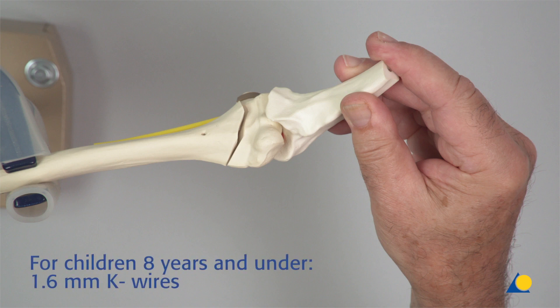For children 8 years of age and under, it is recommended to use 1.6 mm K-Wires. For older children, 2.0 mm K-Wires are recommended, which provide higher stability.